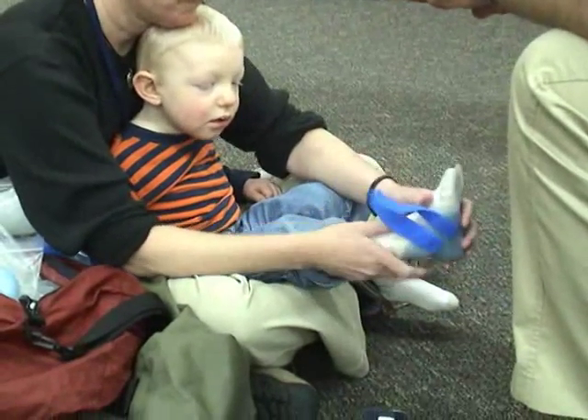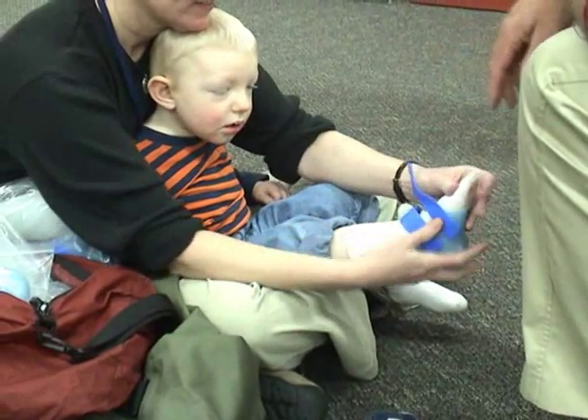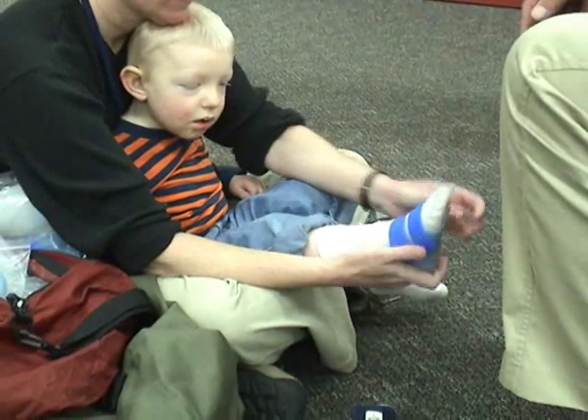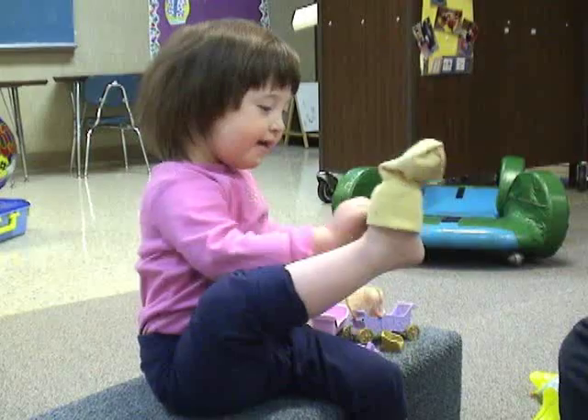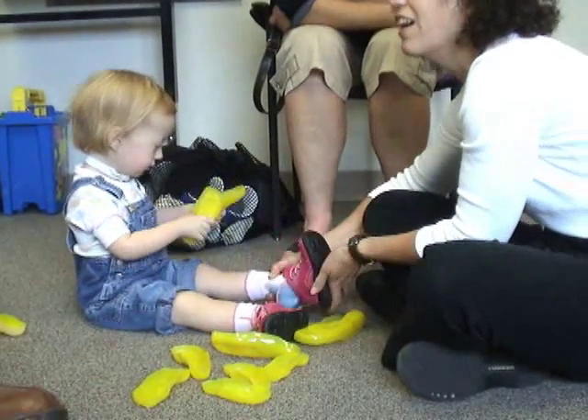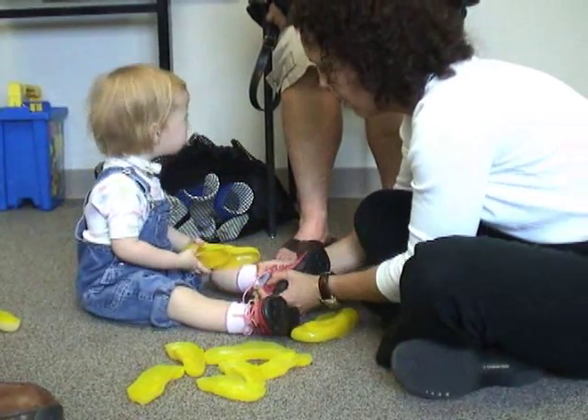The jumpstart system doesn't require casting, but it does require a close evaluation of fit, critical for getting the correct function. The jumpstart in particular depends on both the socks for comfort and the shoes for compression and protection of the toe shelf.